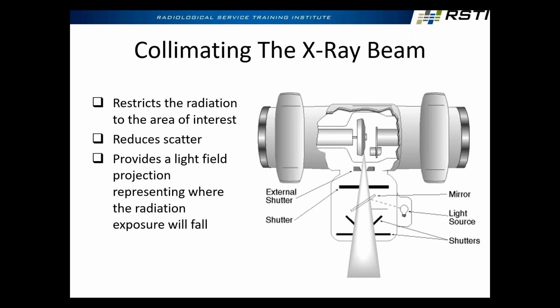Right, right. And that also brings up another important point, and that is applications. Applications training, that's not us, right? On the field service side, on the imaging specialist side, we're there to fix imaging issues and to fix machines, but by law, we cannot tell them how to use it. I can explain the functions of a machine. I can say, if you press this button, it will do that, but I can't say you should do this on that patient. Unless you are a licensed rad tech, it is quite literally illegal for you to tell them how to use that machine.